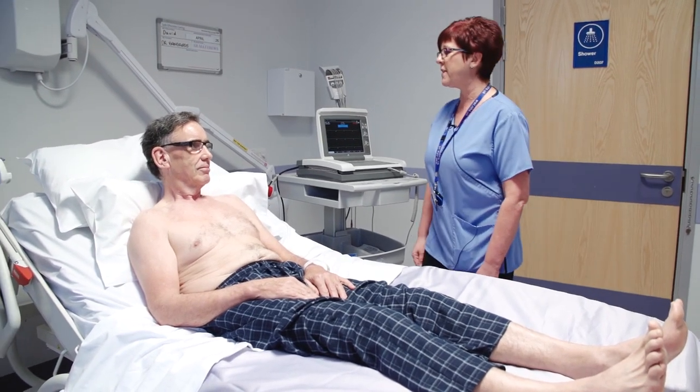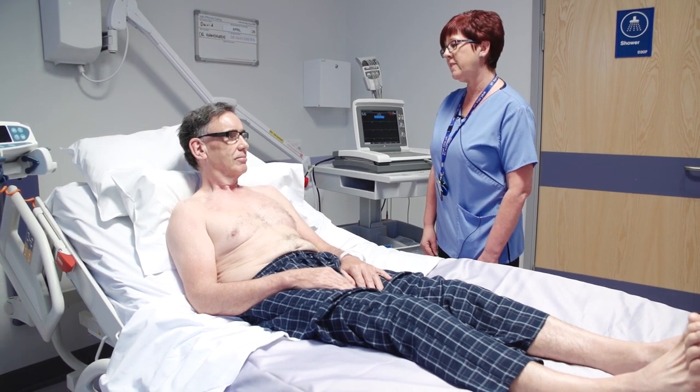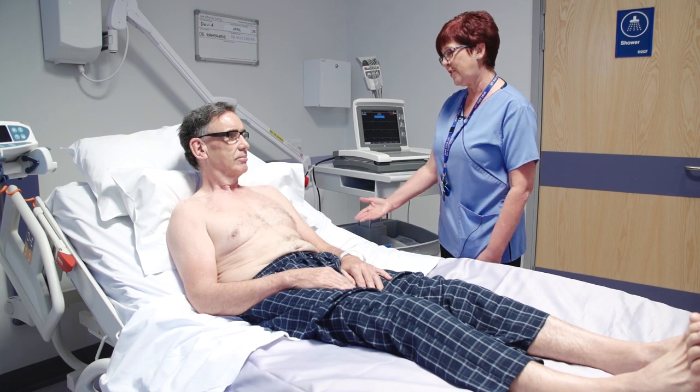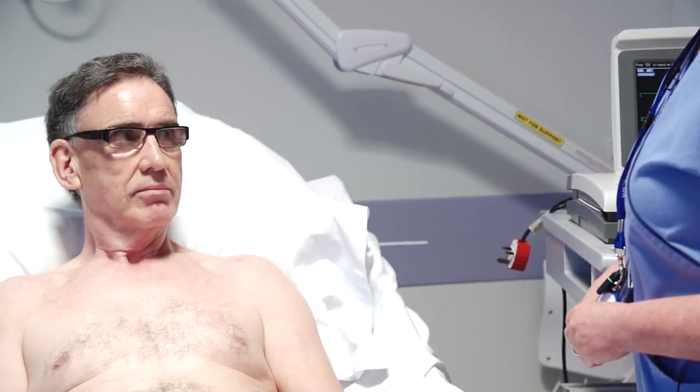Good morning Mr Bond, my name is Karen. I have come to do a 12-lead ECG today on you. Before performing a 12-lead ECG it is important that you gain consent from your patient by asking their permission to carry on with the investigation.